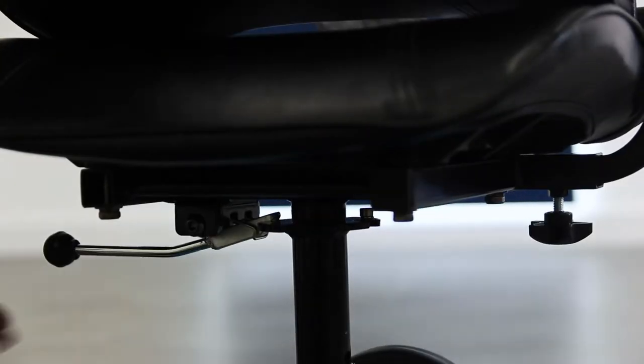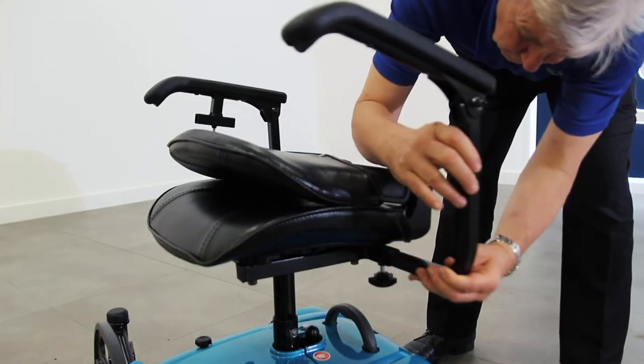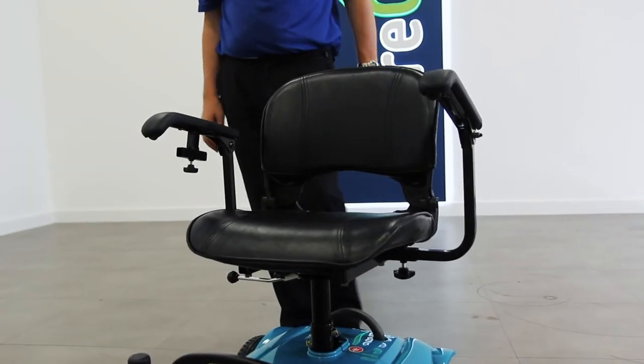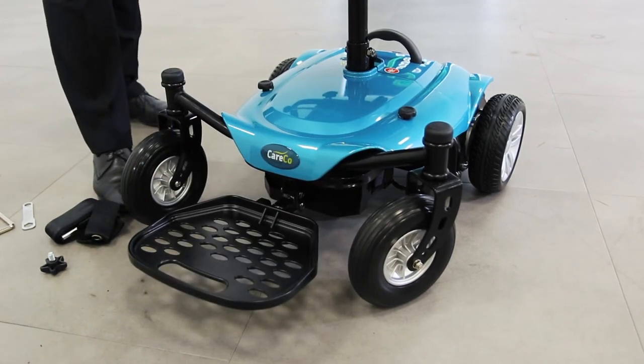Now drop the seat on top of the seat post. You can use the lever underneath to swivel the chair on its base. The armrests on the side are width adjustable and the backrest can be folded up and down. There's also a folding plate for a user to rest their feet while on the move.